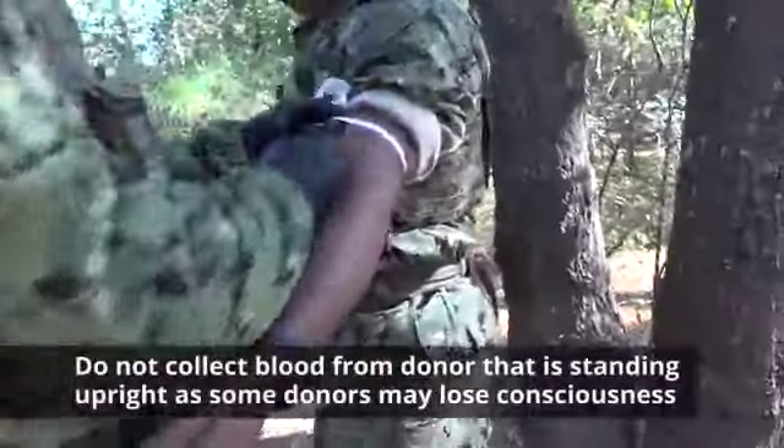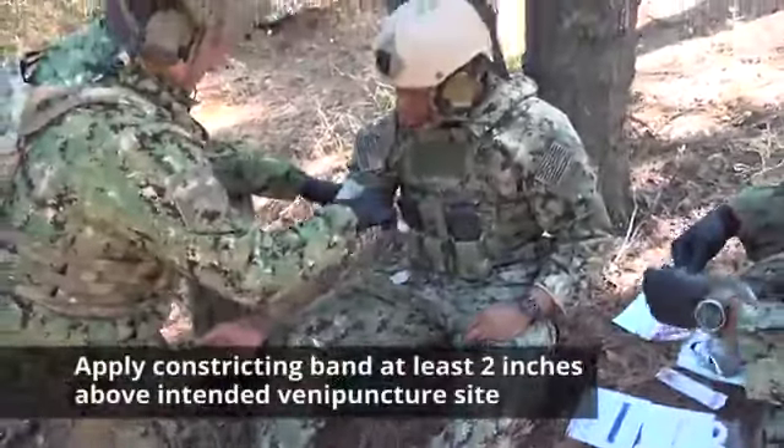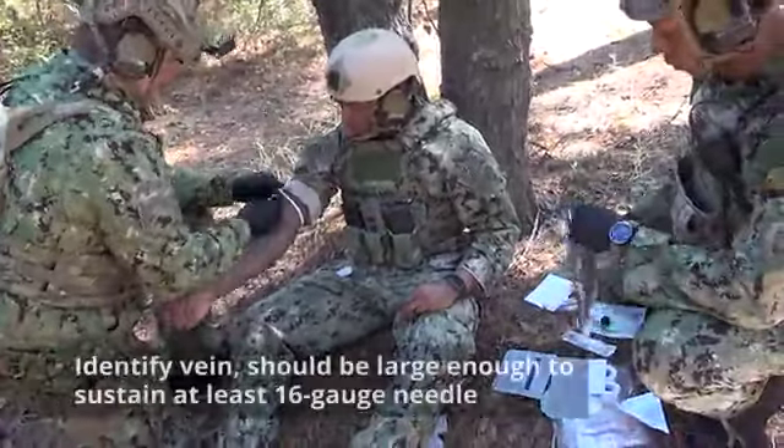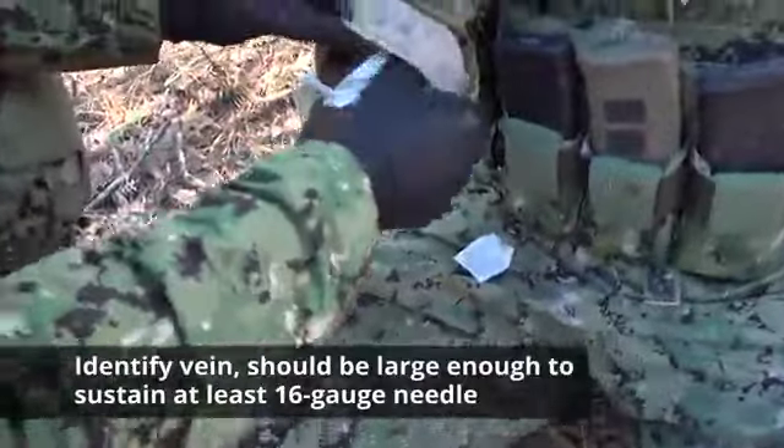Do not collect blood from a donor that is standing upright, as some donors transiently lose consciousness during venipuncture. Apply a constricting band at least two inches above the intended venipuncture site. Identify the vein that will be used — it should be large enough to sustain at least a 16 gauge needle.